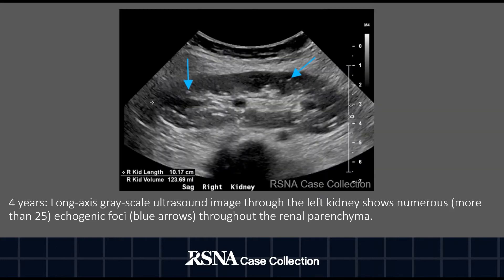This long-axis grayscale ultrasound through the left kidney, obtained four years later, shows numerous echogenic foci marked by blue arrows throughout the renal parenchyma.